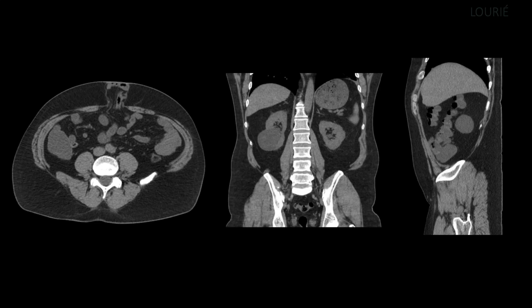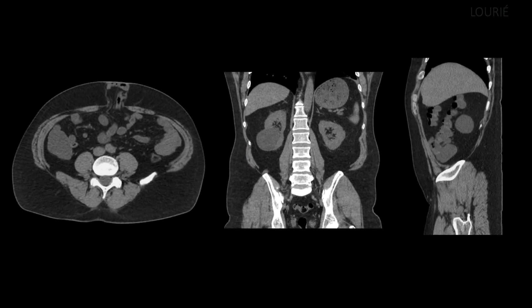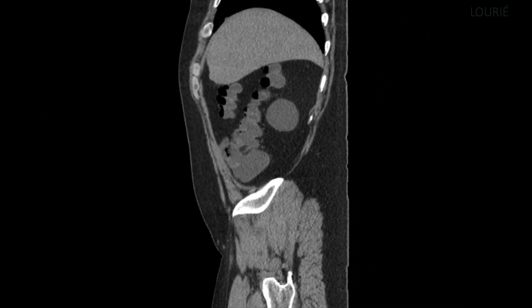In the coronal view of this same patient, focusing on the iliac crest and the right side, we see the external oblique forming a free inferior border with a gap between itself and the iliac crest. The thin muscle separating inside fat from outside is the internal oblique. We also see the quadratus lumborum attaching to the iliac crest. In the sagittal view, near the iliac crest we see the thin internal oblique and thoracolumbar fascia, the latissimus dorsi in yellow, and the external oblique in purple angulating medially as it attaches to the lowest ribs. At the area of the inferior lumbar triangle, there is no covering of latissimus.